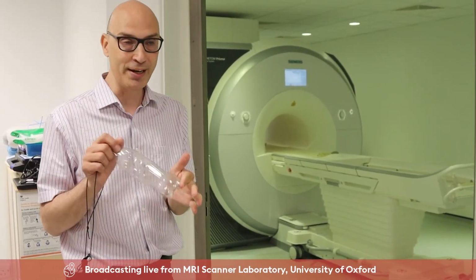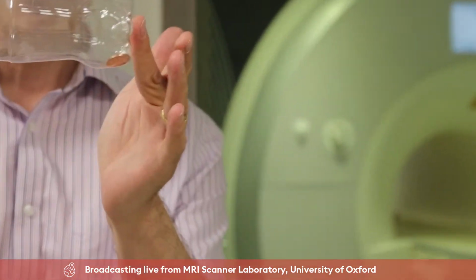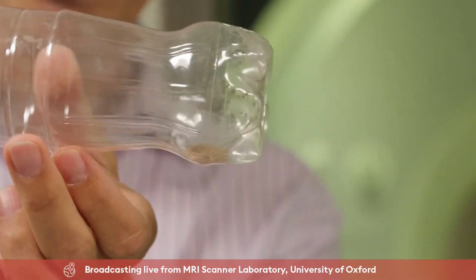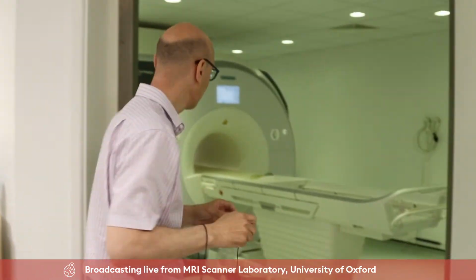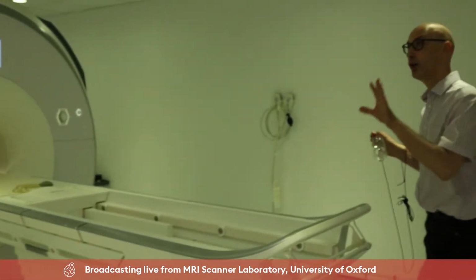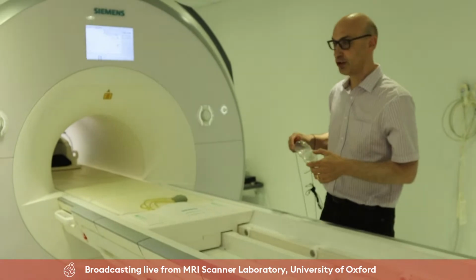Let's just see what would happen if we took something that was magnetic into the room. So you can see here, in this plastic bottle, I've got a penny coin. Let's see what happens when I take it inside. So you can hear it's quite noisy in here. There's a pump on top of the magnet that's keeping it cool.